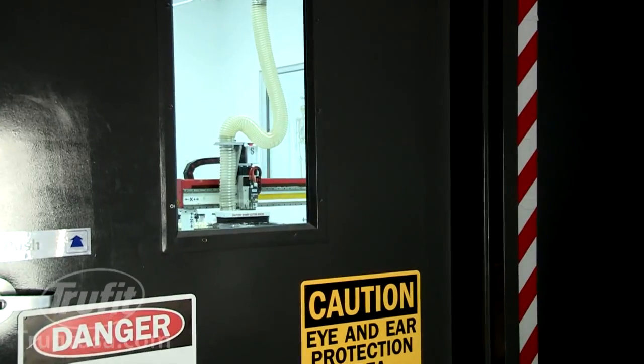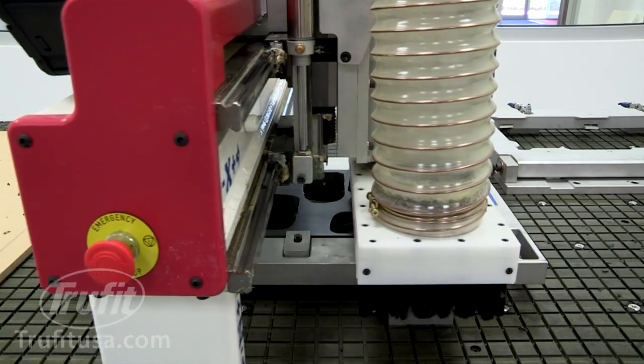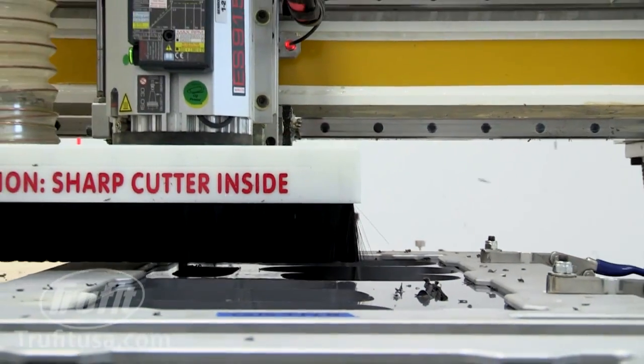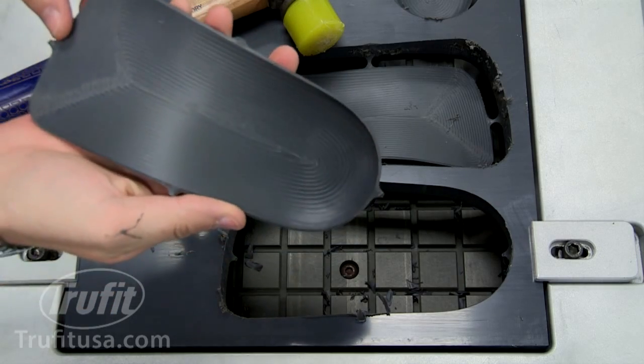After the design phase, highly accurate industrial routers carve the shell from the appropriate rigid or soft material. TrueFit routers allow for shorter turnaround time, higher accuracy, better quality control, and most importantly, superior fit.